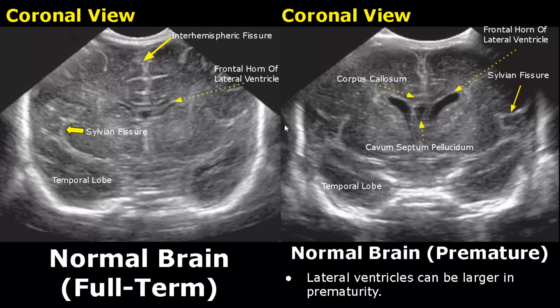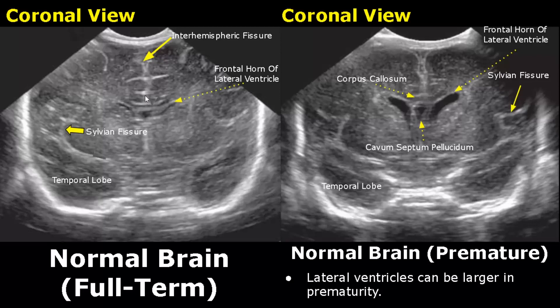Most of the views taken are coronal as it provides the most detail about the brain. On the left side is the normal brain of a full-term infant in coronal view. This hyperechoic line in the middle is the inter-hemispheric fissure. These small hypoechoic structures are the frontal horns of lateral ventricles, and between these horns is the cavum septum pellucidum.